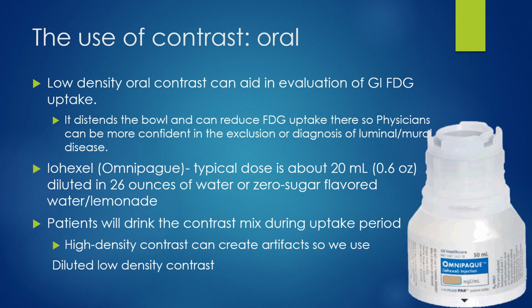If they're females, you'll confirm that they're not pregnant. And then you take their blood glucose levels and record that, start the IV, inject them. And then during that 60 to 90-minute uptake is when they would drink this oral contrast. Then you have them go to the bathroom right before you put them on the camera, and scan them. And then somewhere in that time, you take the IV out and they're free to go.